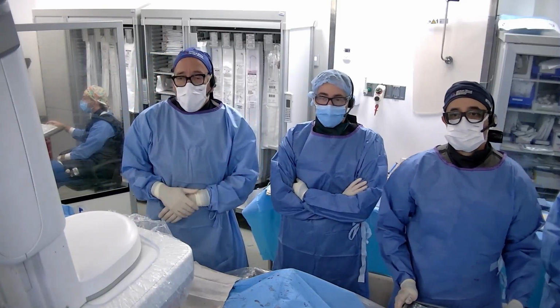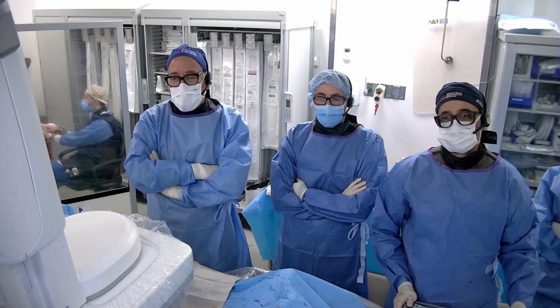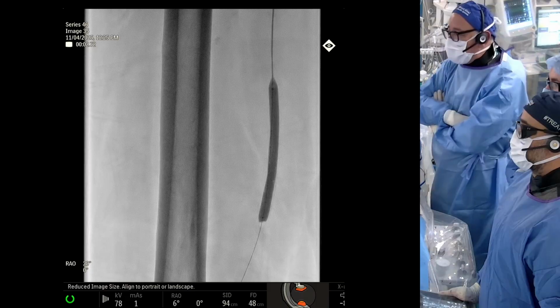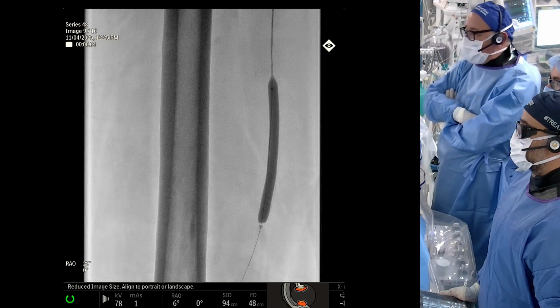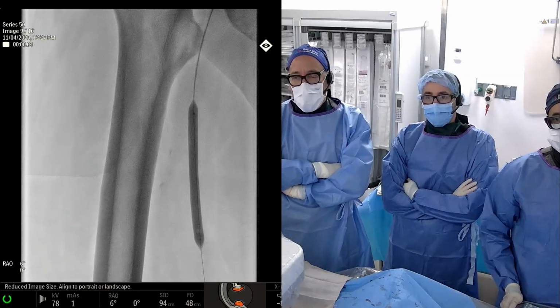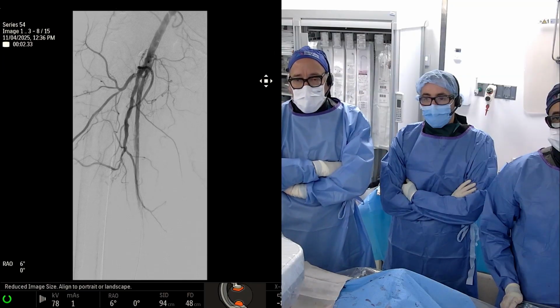You want to show us what you've done next? Yep. So we did IVL. I'm sorry I couldn't recognize the voice of who said IVL, but clearly we're thinking about it the right way. And we used the new E8 catheter, 6 by 80. And, not to be over jubilant, but I really like the E8. I think most of us do. It made this go very fast. We did the whole length of the SFA in about 3 or 4 minutes maybe. But that was very, very helpful.